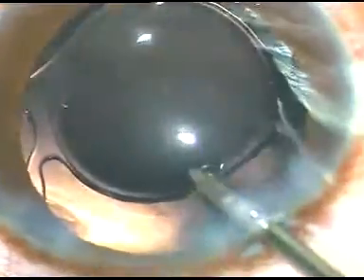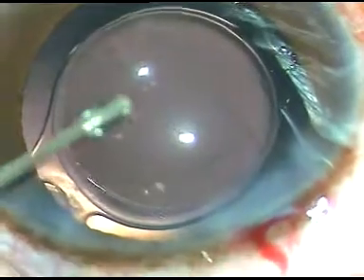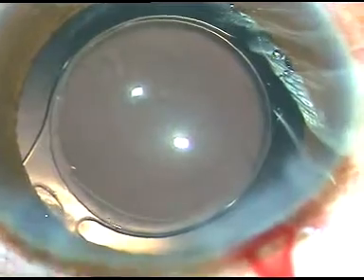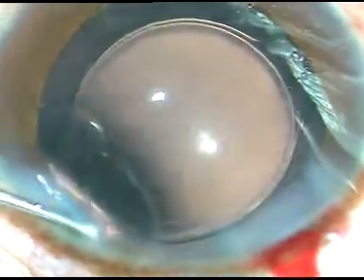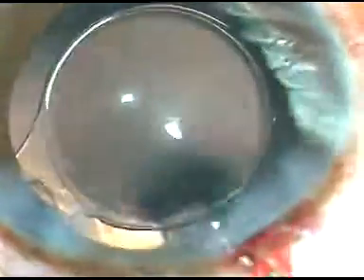I go behind the eye wall and irrigate that area. You can see the posterior capsule is very nicely clear — there are no cells on the posterior capsule. A little bit of moxifloxacin has been injected into the anterior chamber. There is only one side port in this case and it is hydrated. I just have to form the anterior chamber very nicely.